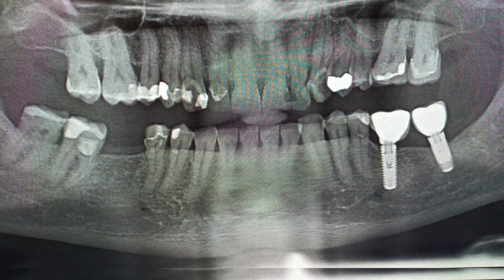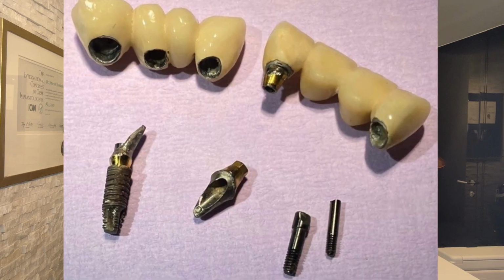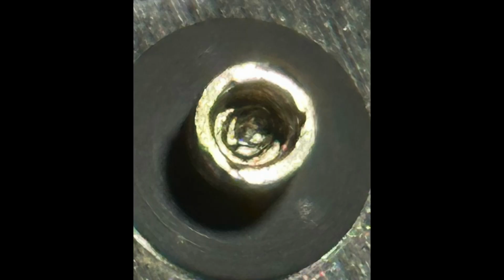So what are we doing with those abutment screws that are getting loose, since we are lacking in suitable educational resources? Instinctively we tend to tighten those screws even more. But now, without addressing the occlusal issues, those over-tightened abutment screws will break.